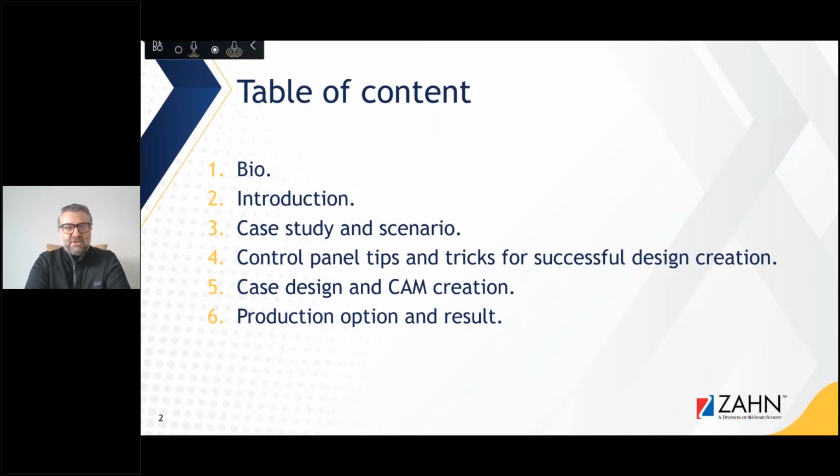For the presentation, we're going to start off with a small bio and the introduction as well. We'll talk about the case study and the scenario, how the case presents itself. We'll talk about the control panel tips and tricks for successful design creation. We'll jump ahead with case design and CAM creation, as well as production options and the final result.